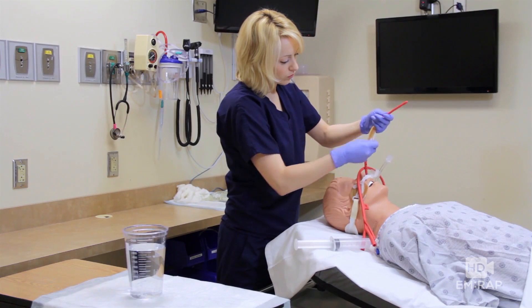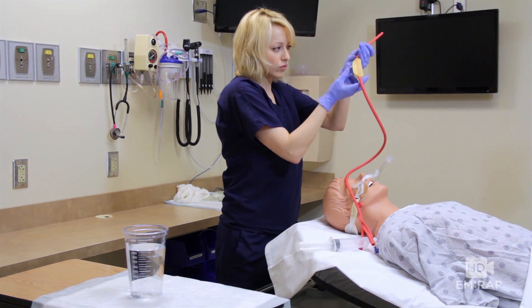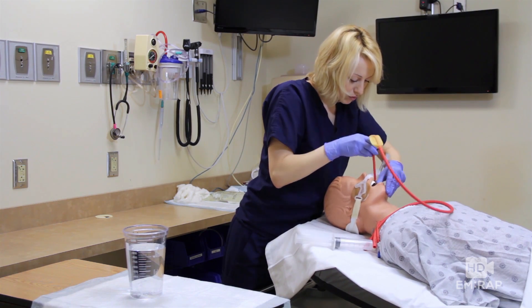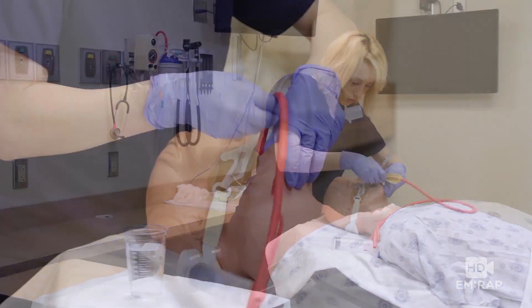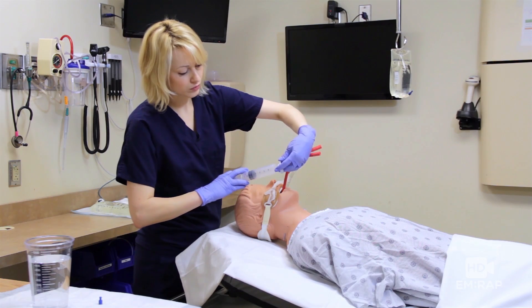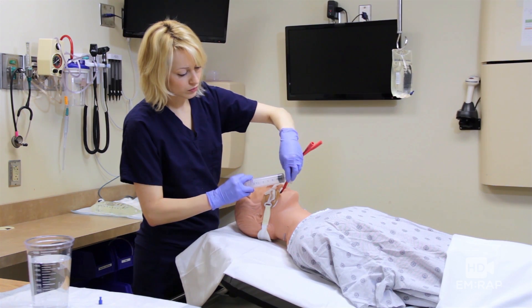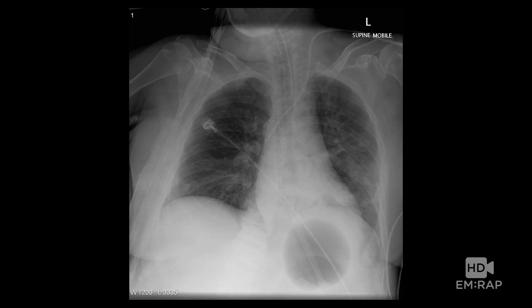Get some lubrication on the tube and the balloon, and you're going to insert it just like an OG tube. You could also go through the nose, but we're going to go through the mouth. Insert it all the way. We want to make sure that this thing is in the stomach, not the esophagus — that is not good if you inflate it in the esophagus. So give it 50cc's of air and get an X-ray. Make sure that balloon is below the diaphragm.